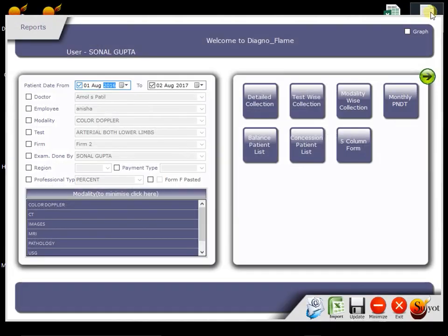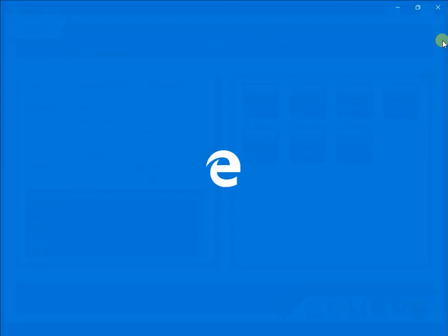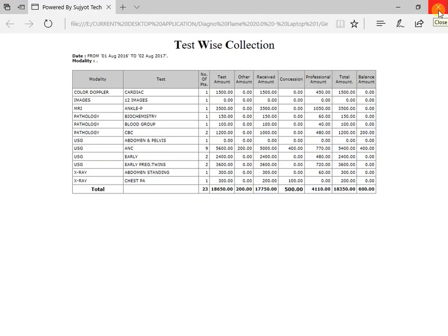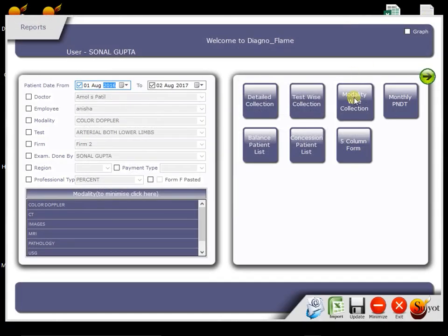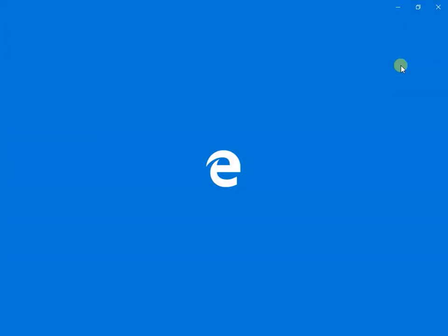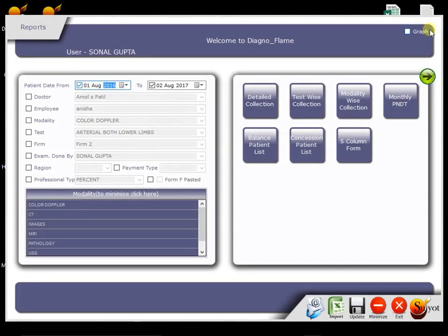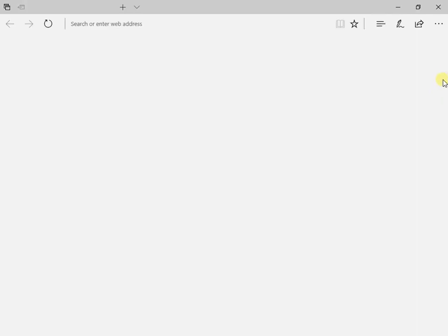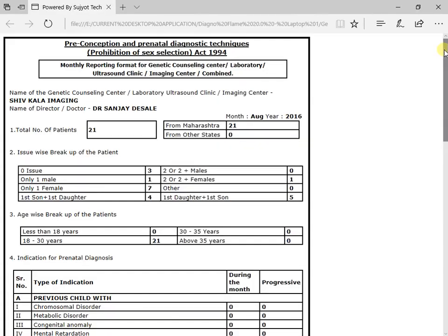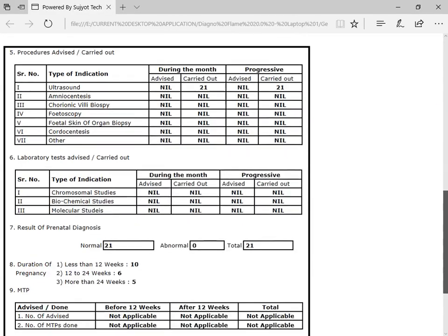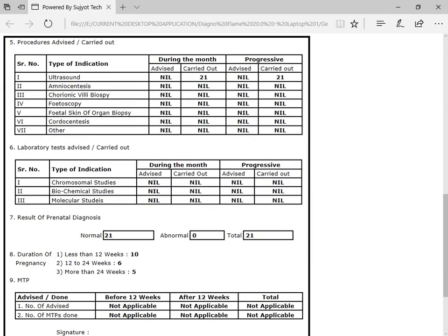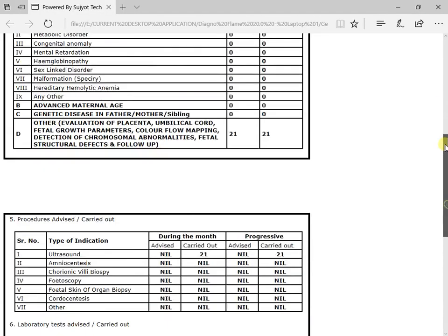Same thing I can see test-wise, like which test is being done mostly in our clinic. Same thing I can see modality-wise. Like I can segregate patient modality-wise. We also get the monthly PNDT report from this software. So we can tally the government report and software report.